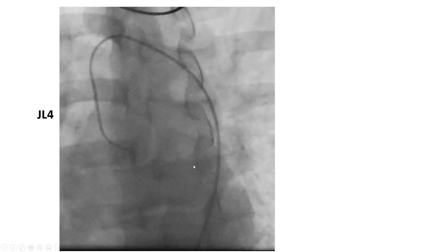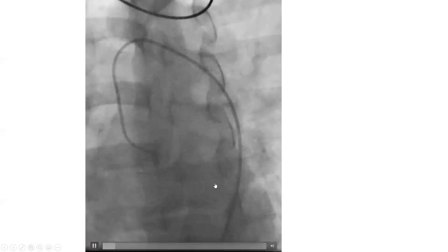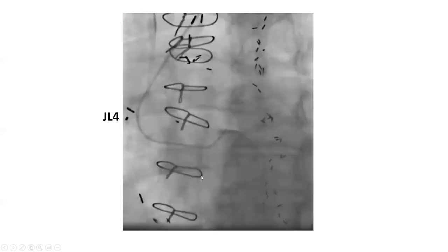This is an easy femoral case. Just by looking at the catheter shape before contrast injection, what's the next step? This is a JL4 and you can tell it's pointing way too much down — the coronary is above you. The next step is JL3.5, and it engages very nicely.